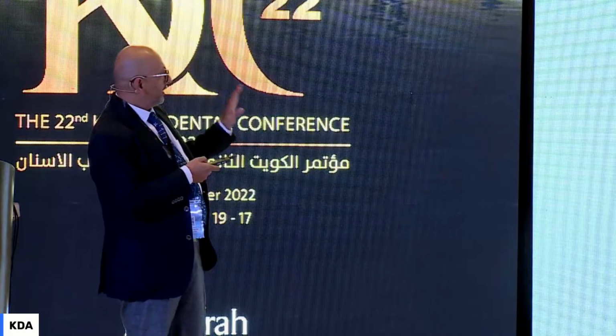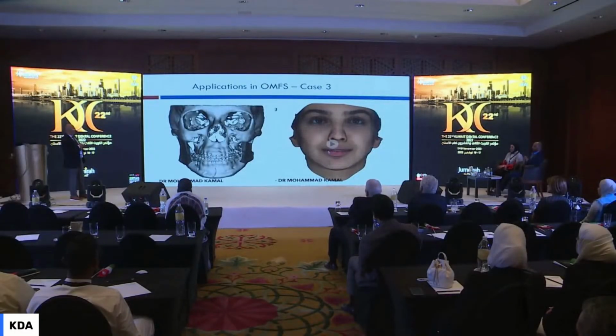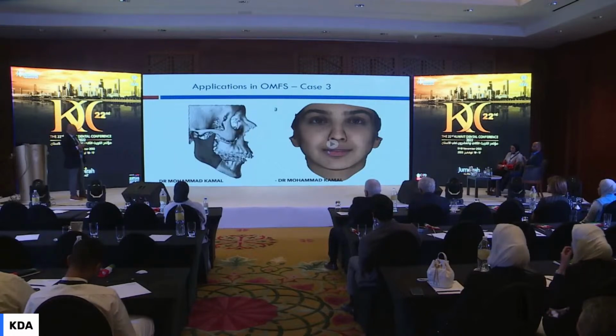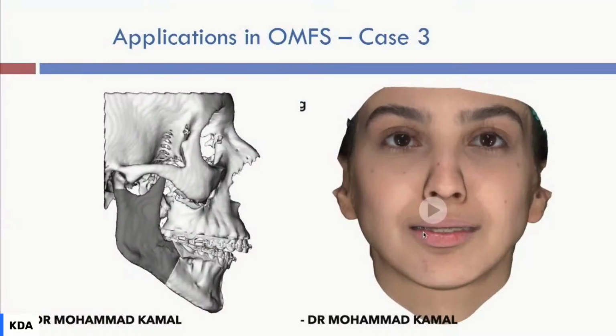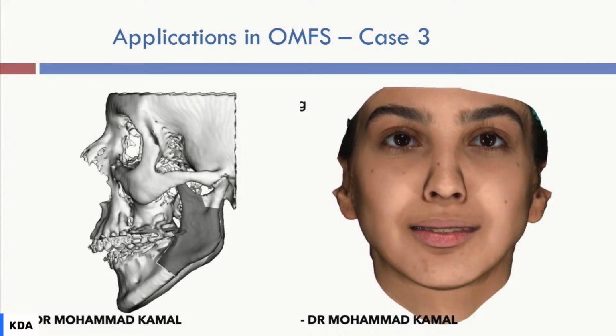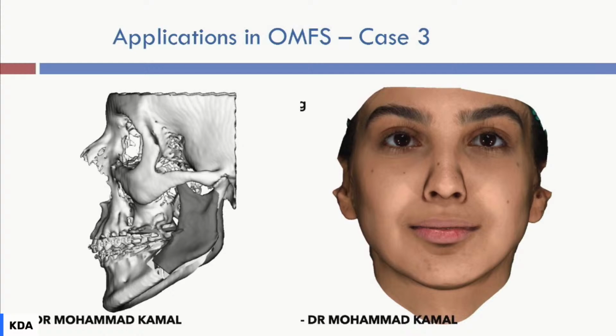And then, same thing, prediction of the hard tissue. We're going to improve the gonial angles if we advance the mandible. Look, if we advance the mandible, that's about 10 millimeters, 11 millimeters advancement. Then you have improvement of the chin, improvement of the gonial angle. There is no need to touch the maxilla at all. So let's look at the other picture.